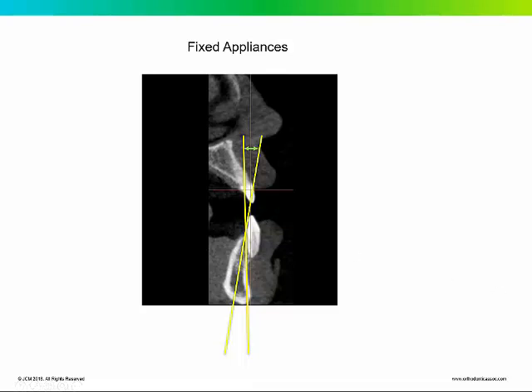What about aligners? Very similar. With aligners, you run the line through the center of the clinical crown. I'm not sure how predictable torques are using aligners, but if you were to use aligners, at least an attempt to get the tooth recaptured into the alveolar housing would be in the right direction. Keep in mind that when these teeth are set up by the aligner companies, they're only looking at the clinical crowns, and there's no consideration for the alveolar bone or the root.